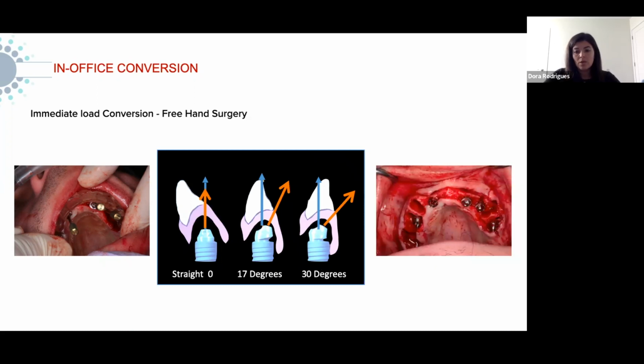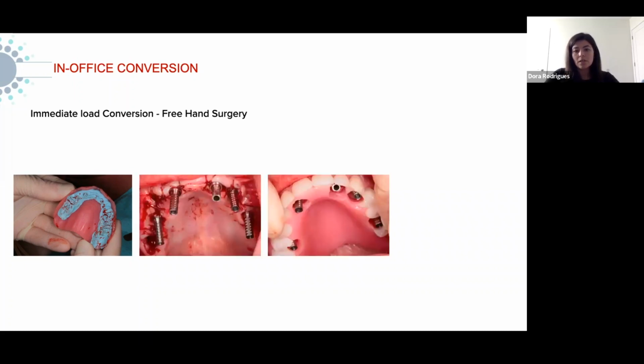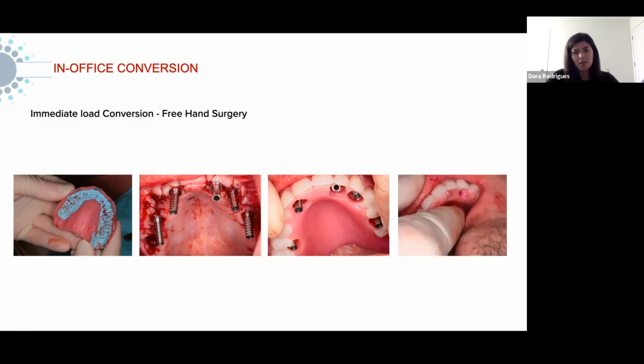So once we place all our abutments, in the freehand surgery, the traditional way of doing the conversion, you basically use blue mousse on your denture to mark the position of those multi-unit abutments or healing caps, depending on what time you do them. You place your cylinders and you have to drill holes through the denture to make sure that your cylinders sit passively through the denture. Your denture has to sit in the mouth, not touching or rubbing any cylinder, giving free space around it, at least 1 millimeter all around, to make sure that when you pick up, you have enough space for the acrylic to go around the cylinder. Then you pick up your denture on the cylinders with any acrylic that you might want, and then you just finish the case as you go.